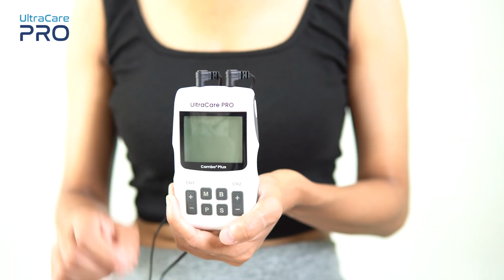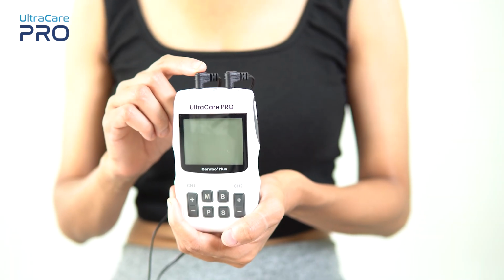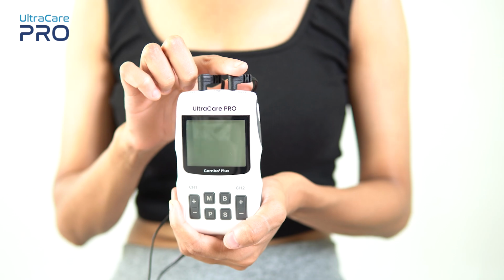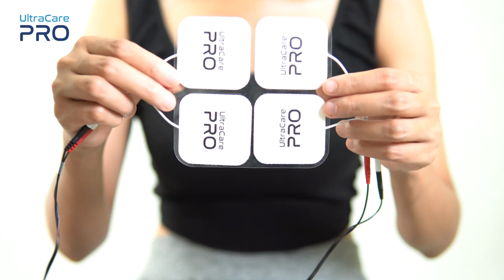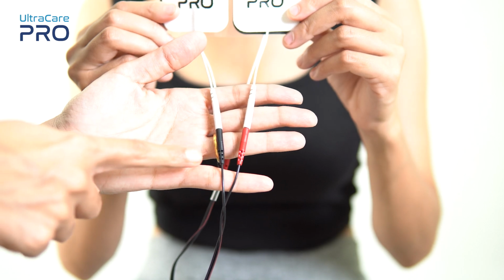Wires attached to this electrode comes from channel 1 and channel 2 of this device. Each channel supplies current to two electrodes, one of red color, another of black color.